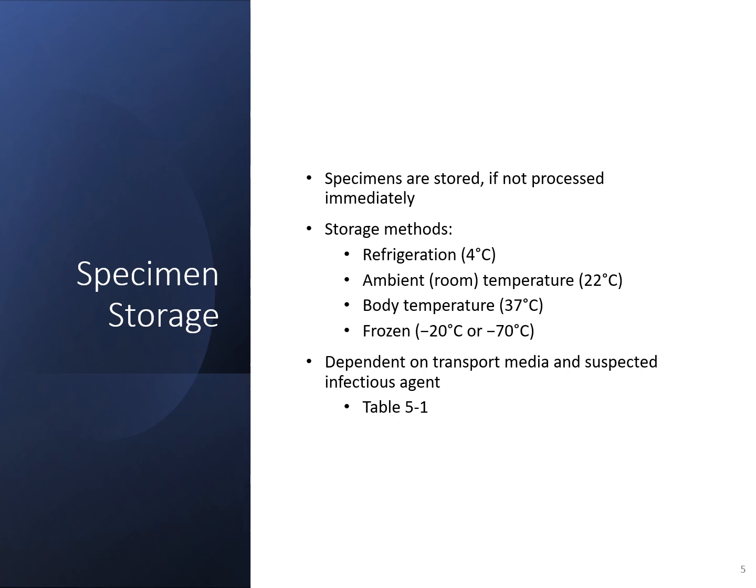It can be dependent too on exactly what organism you're looking for, which you'll learn a little more about once we start getting into those organisms, and which ones are more temperamental. Depending on the specimen, it could be stored refrigerated, at room temperature, body temperature, or even frozen.